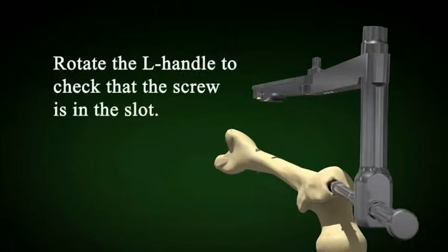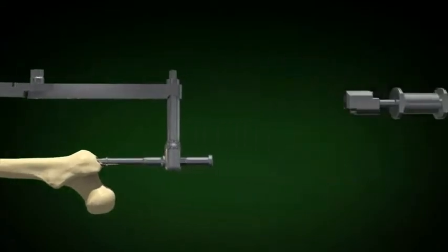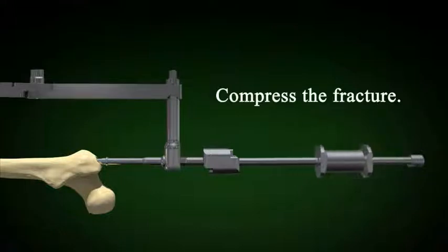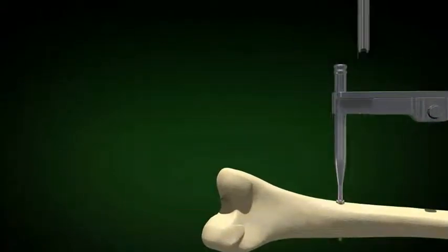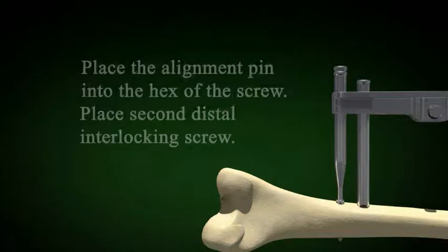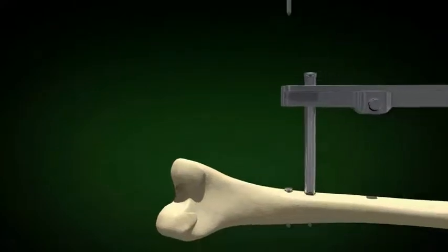Rotate the target arm to be sure that the screw is in the slot of the nail. Compress the fracture site. This is described more fully in the technique video. If you place a second screw, put an alignment pin in the head of the most distal screw and proceed identically to the insertion of the screw in the second slot distally.